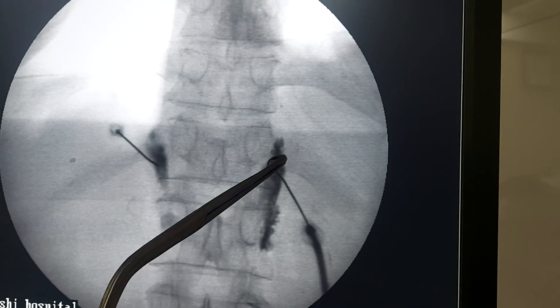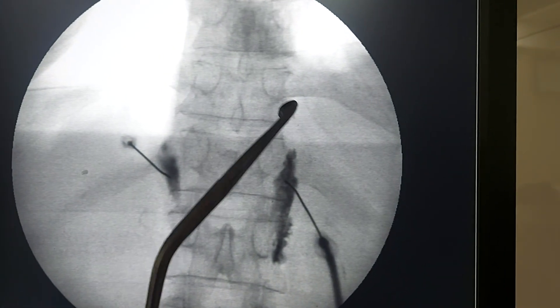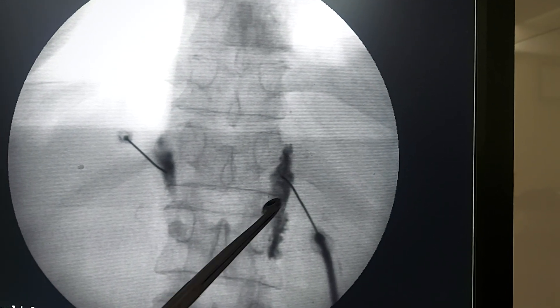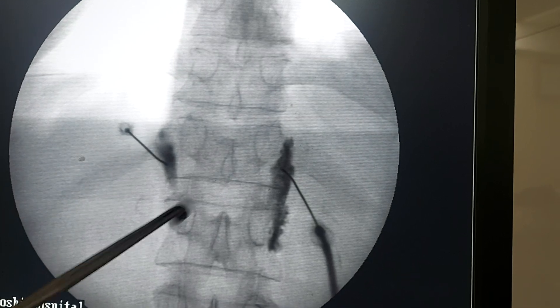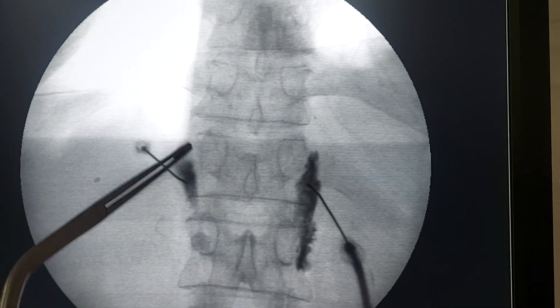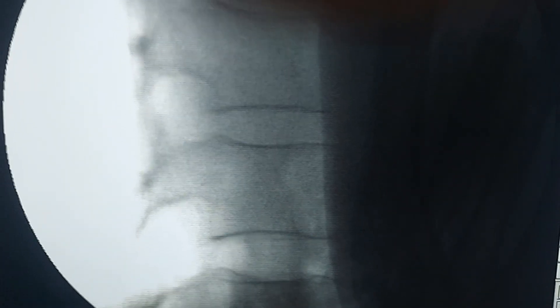We have just entered near the rib. Here is the transverse process and this is the rib. We have entered on both sides and given the dye bilaterally. You can see the dye is hugging the vertebral body very nicely.